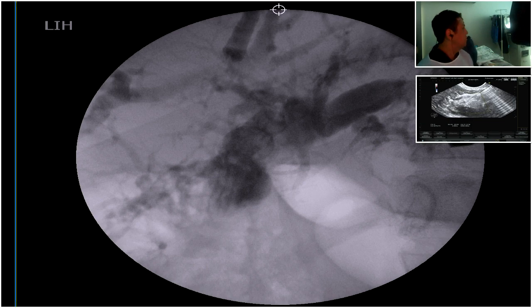There are not stones. There is air. This is air. That's the difference between cholangiography and MRI, cholangio MRI. So there's a good passage of contrast. That's why the bilirubin levels are normal, and that's why we have air inside the biliary tract. So I think there is nothing to do here regarding therapeutics by endoscopy or radiology in this case.